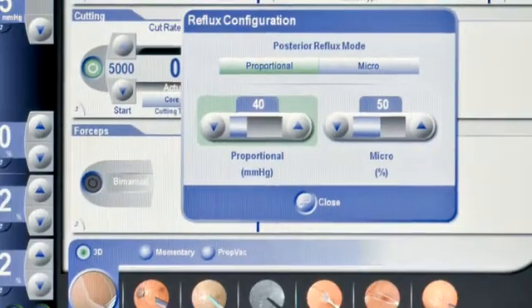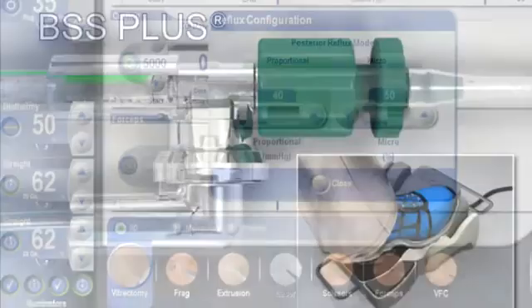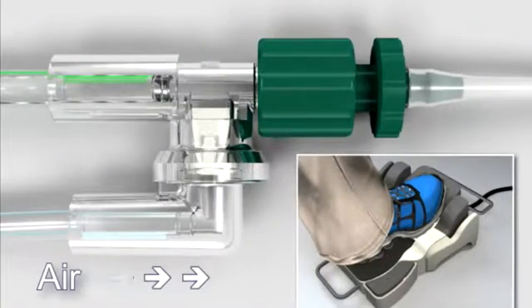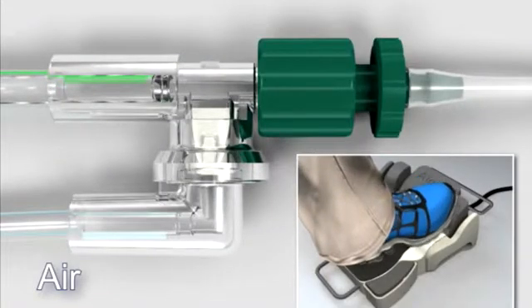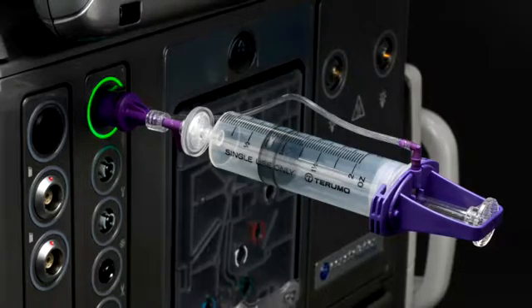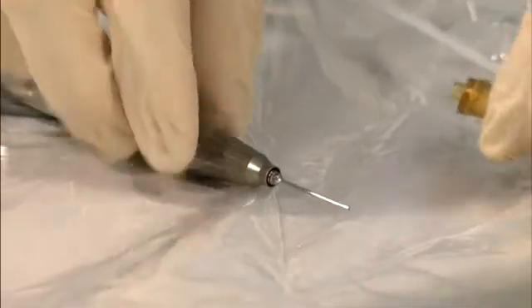Additional posterior segment functions include proportional reflux, automated fluid-air exchange, single-person acquisition of gases used for intraocular tamponade, and lens fragmentation.